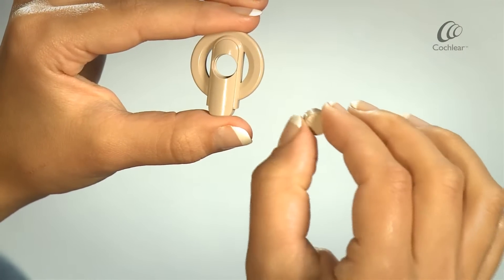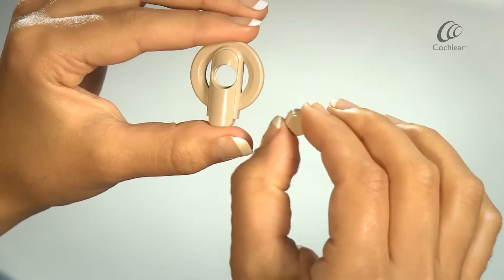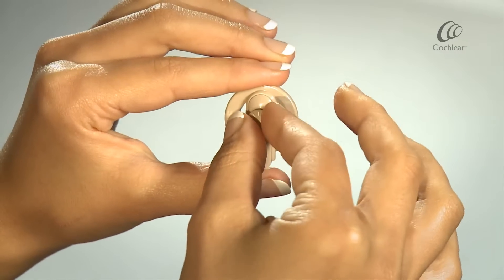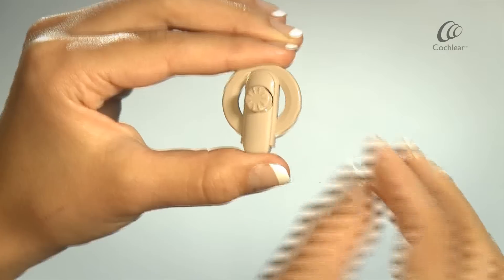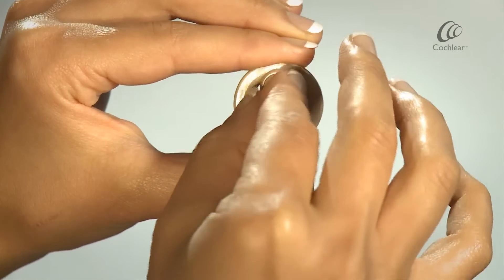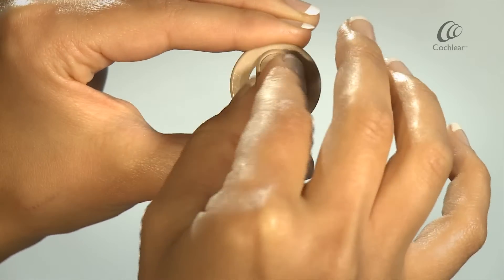To insert the magnet, ensure the smooth side of the magnet goes into the coil hole first, matching the grooves of the magnet to the grooves in the coil. Turn the magnet clockwise until it's in position.